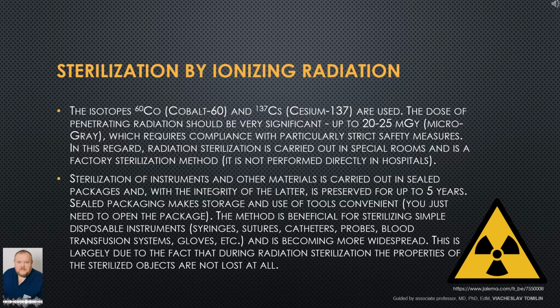This is largely due to the fact that during radiation sterilization the properties of the sterilized objects are not lost at all.